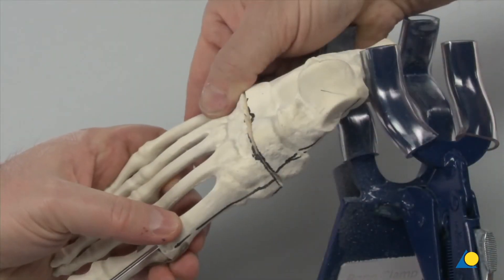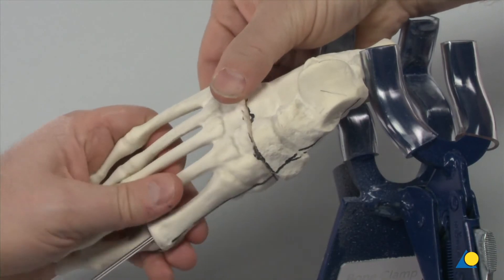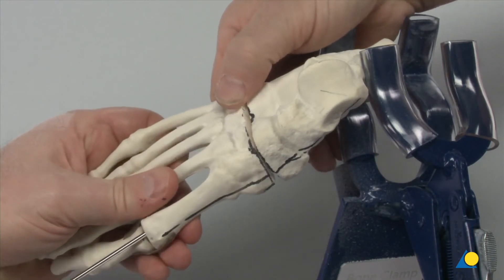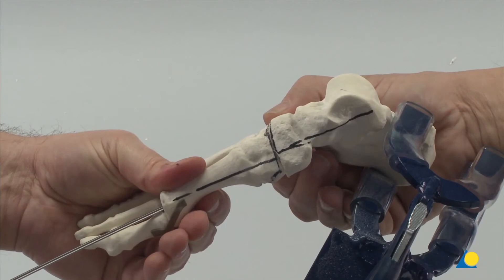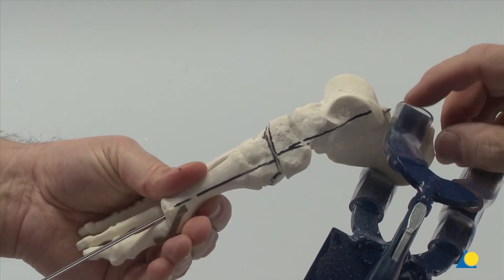The bones are aligned and reduced, adjusting for pronation or supination as well as abduction or adduction. The guide wire is now advanced across the osteotomy as far as the proximal talus, while maintaining the realignment of the medial column.